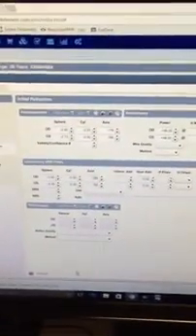And right now you don't see anything, but if you go back a couple of screens, it'll populate. So as you can see now, the autorefractive data is in there, the keratometry data is in there, the lensometry data is in there. If I go forward a little bit, see this screen right here, there's no information because we didn't put anything in. Actually, with this screen, nothing really transfers from the Topcon Phoropter.